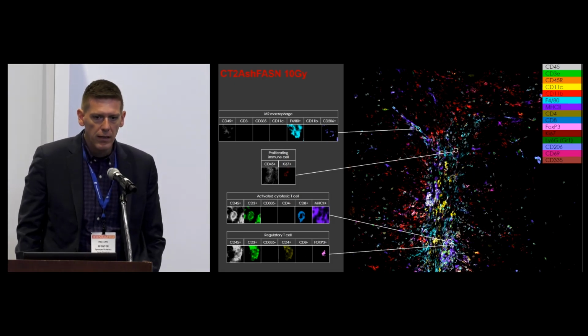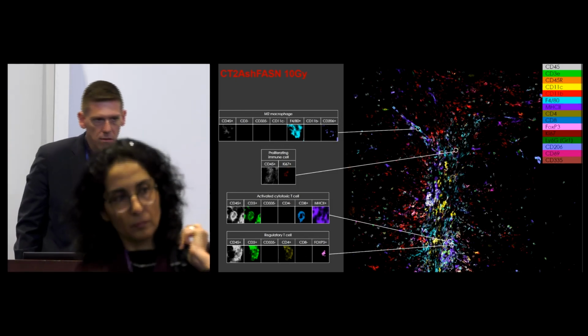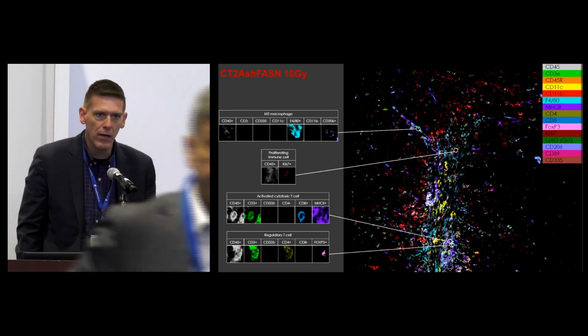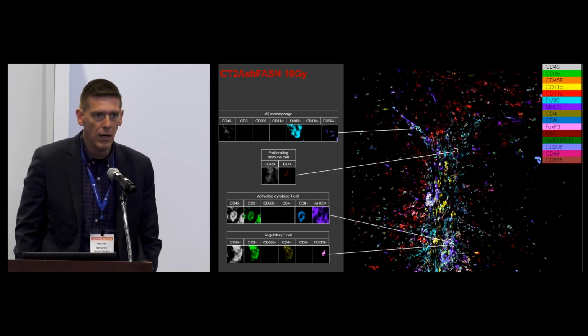We found that there's a correlation among all these methods as far as what markers need to be stained first versus stained last. Like CD19 is a bear for everybody. CD3 seems to be a bear for everybody, and we're not really outliers there. So it has everything to do with the clone that you're using in the preparation. There are some considerations, but there's nothing specific to our method.